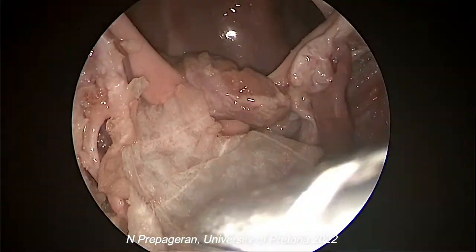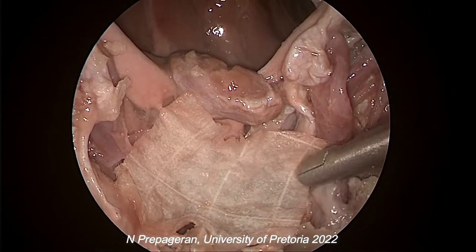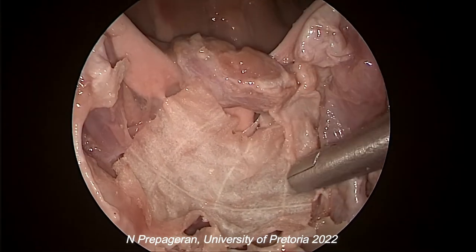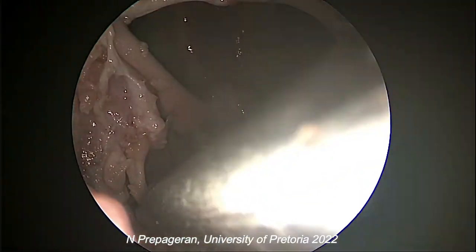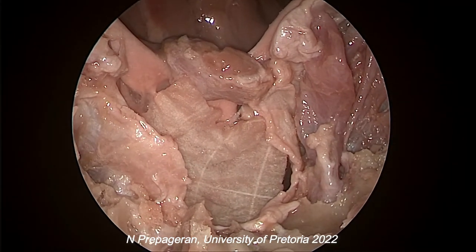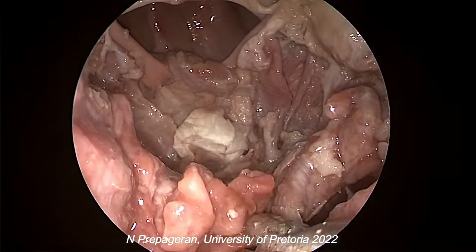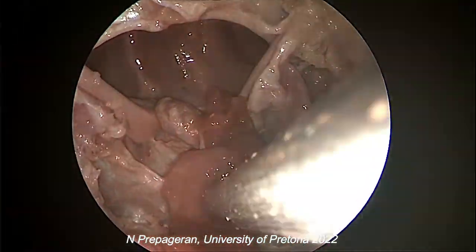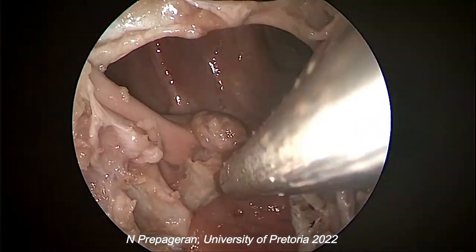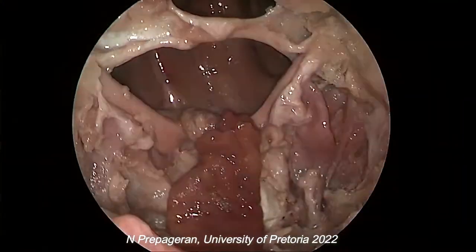By taking a piece of fascia, we cover the defect. Either we do a gasket flap, or we put a fascia and make sure that the dura covers up the edges as much as possible — this is just a demonstration using a piece of paper. Once the dura has been tucked in at all the edges, make sure that it is watertight. You can put a piece of fat on top of it, and then the septal flap that has been raised is now placed on top of the repair. Obviously depending on the size of the defect, the flap is tailor-made according to the size of the defect. Then tissue glue is applied on top.